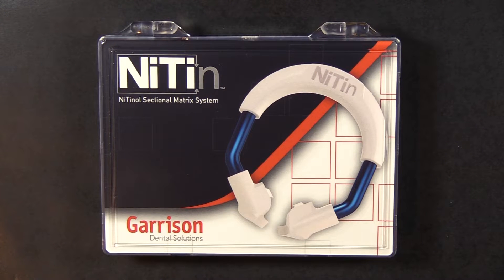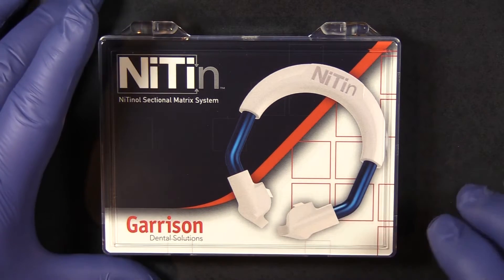Hi everybody, this is Kevin with Garrison Dental Solutions. I'm talking to you here today for Curion about the Nitin sectional matrix system from Garrison Dental Solutions. It is a fantastic product and we're going to take a quick review of it and some of the features of the Nitin system.